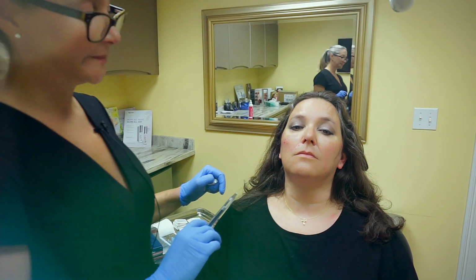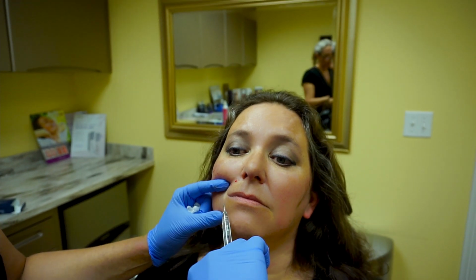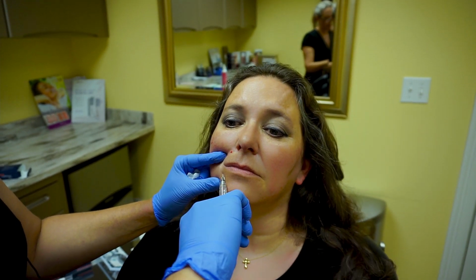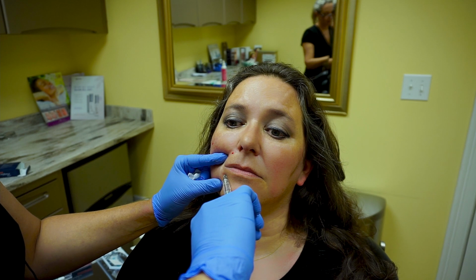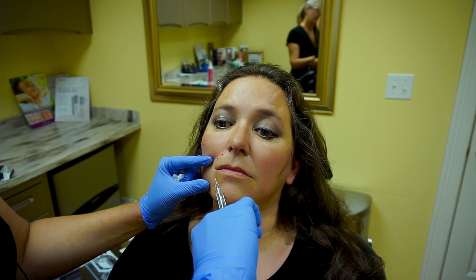So can you get that? You see it? So this is going up, that's going down. We'll get it to turn up in a minute. Put a little bit more. Usually I do sort of like a K shaped. The more I put in, the more I get it to turn up. So we give that sort of perpetual smile. I'm going to use the rest of this for this little indented part here so it's not quite so harsh.